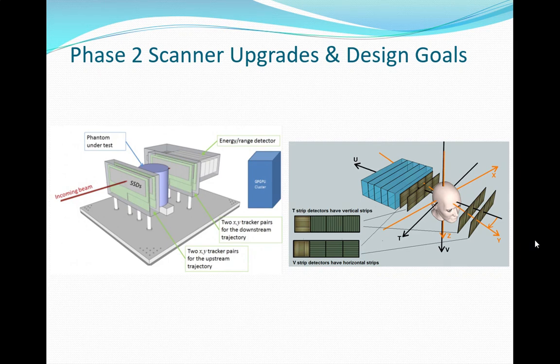Right now we can track a little bit over 1 million particles a second. We'd like to get to 10. 10 is full speed. So we have to throttle the accelerators back in order to image right now. If we can get to 10, no problems. Okay. Does this make sense as an idea?